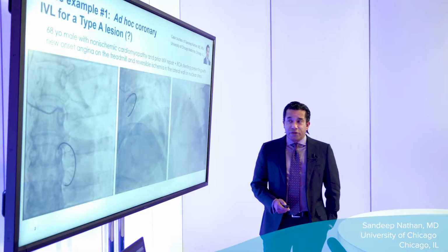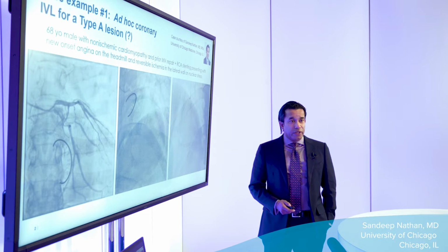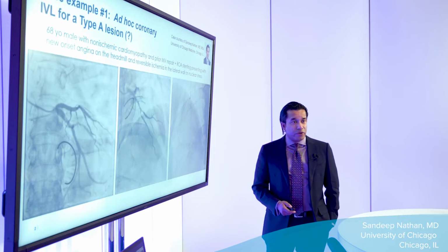It's a pleasure to be with you, and I'd like to walk through a couple of cases with you where we used Shockwave IVL for a very satisfactory technical result for coronary intervention. So case number one is interesting because on the face of it, it really jumps out as a very straightforward lesion. And I think there's a lot of learning here because we focus on the technically complex lesions, the lesions where we look at the angiogram and say, this is going to be a bear to tackle.